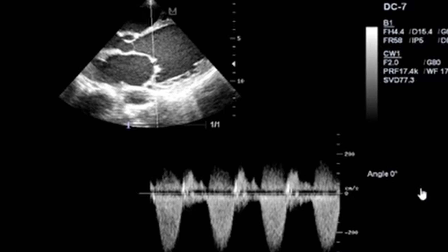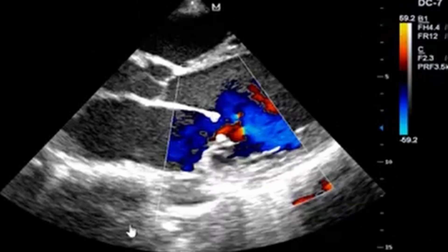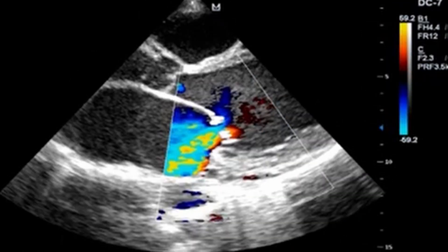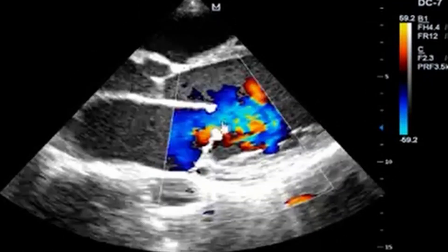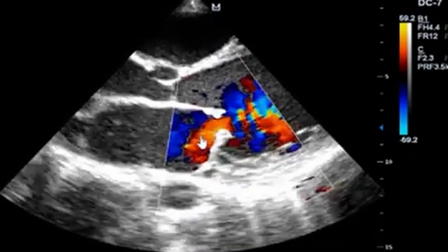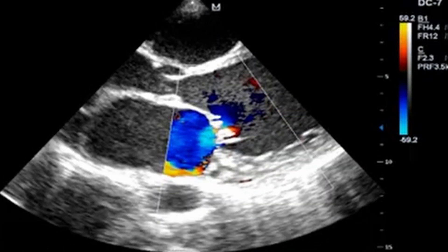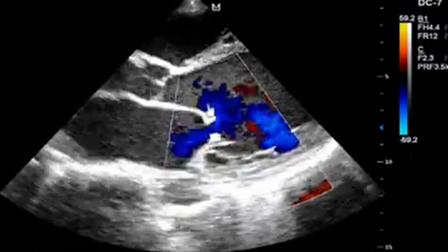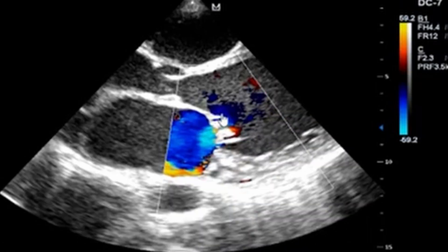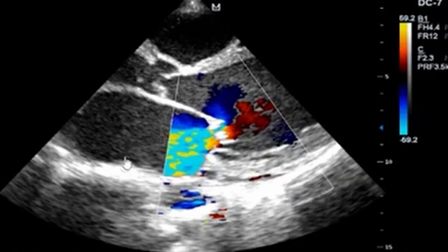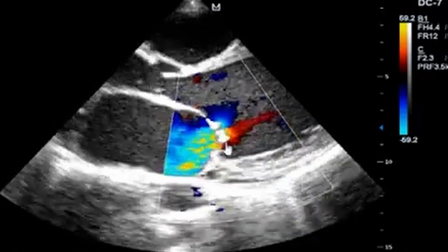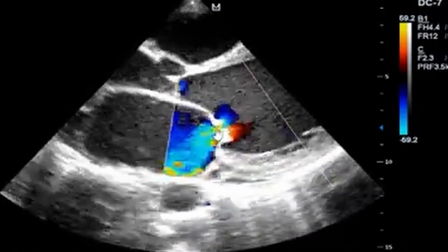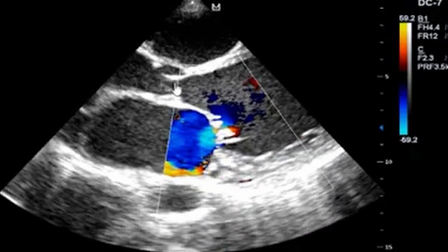The mitral valve is stenosed, hence we find reverse flow. You can see the yellowish color within the bluish — this is what you call regurgitation. You can see doming is present, and you can appreciate that the mitral valves are calcified.